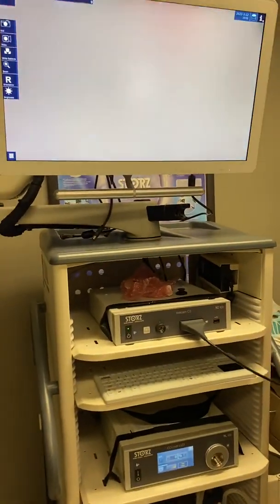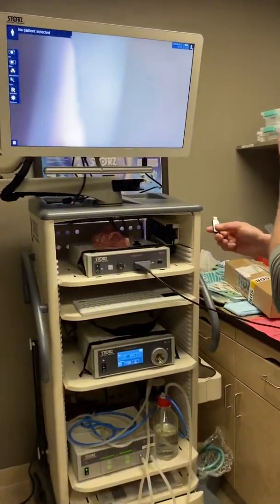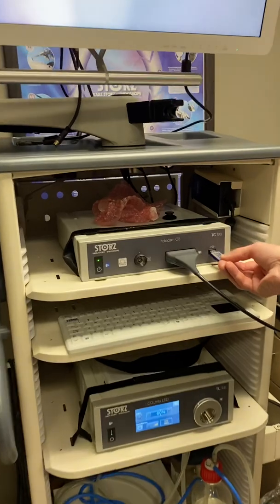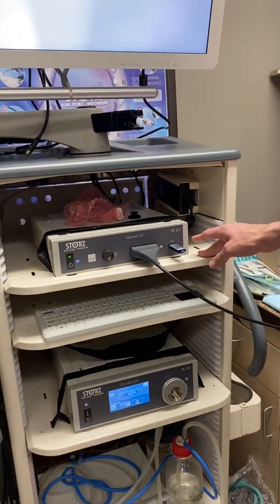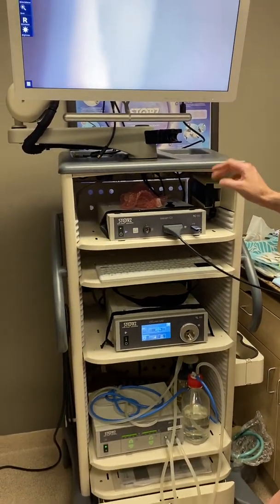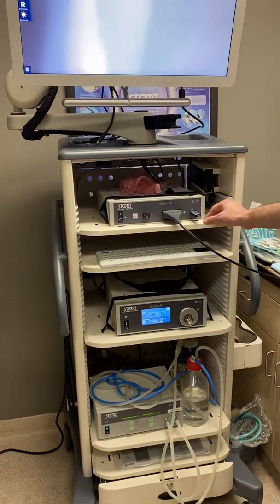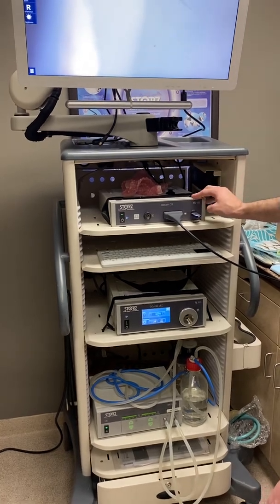That's one of two things that need to be plugged into the camera box. The second is the USB drive. The USB drive allows you to take pictures and videos during procedures — you need to have it plugged in, otherwise the system will not let the user take pictures and videos.